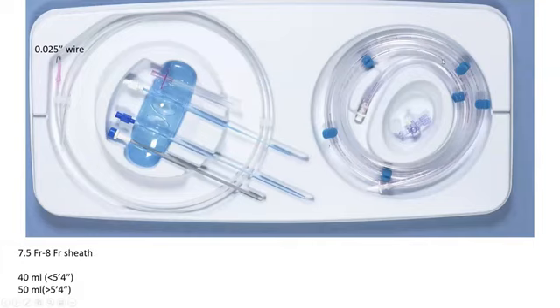The second tray has the extension tubing for the helium line, which is this, which you connect eventually once you're in the body, ready to augment. And you have extension tubing for the arterial line, usually 40-inch line tubing, which you flush. Okay, you flush that line. And you remove this from the tray and you make it ready for eventual connections.